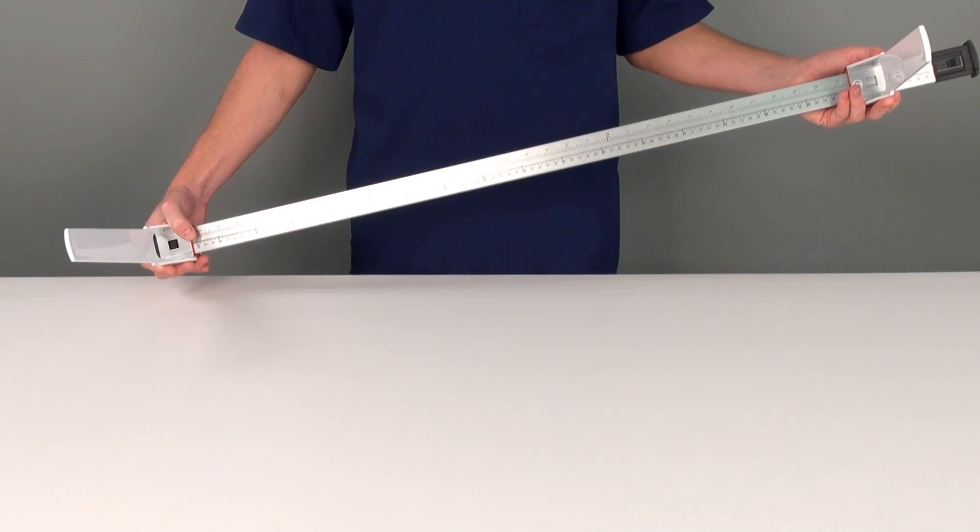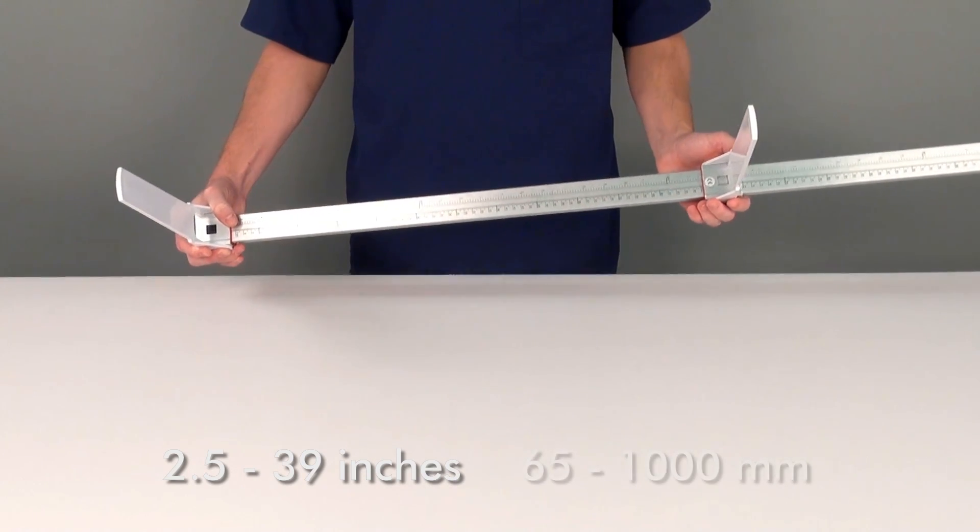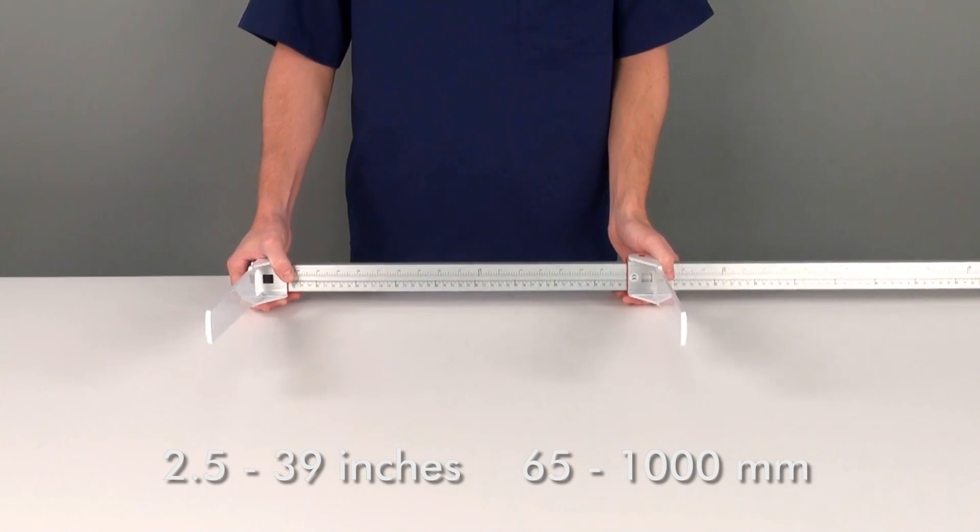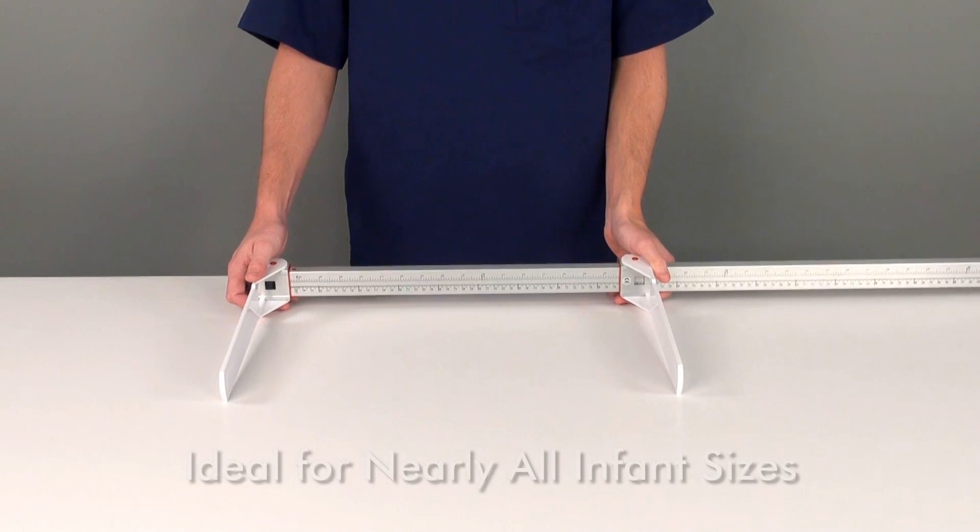The MLM is capable of measuring between 2.5 and 39 inches and 65 to 1000 millimeters with graduation increments of one-eighth inch or one millimeter, which makes it ideal for nearly all sizes of infants.